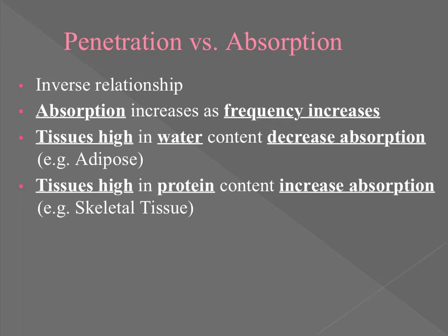The depth of penetration of ultrasonic energy in the tissues is going to be inversely related to its output frequency. So remember I said early on, a 3 megahertz treatment is going to be absorbed by the superficial layers, and a 1 megahertz treatment is going to be absorbed by those deep tissues, right? We're coming back to that concept. So the lower the output frequency is, the deeper the penetration will be in the actual tissues, right?